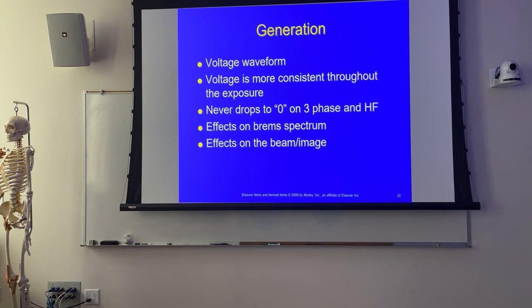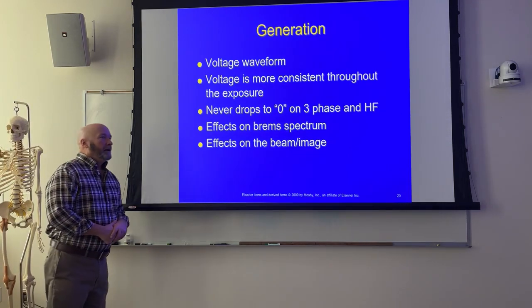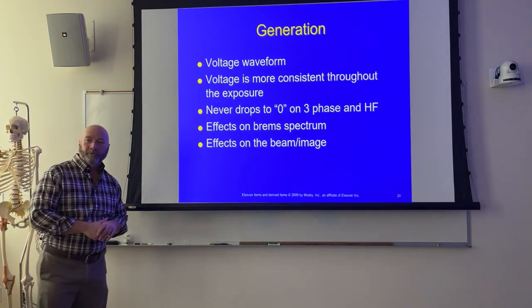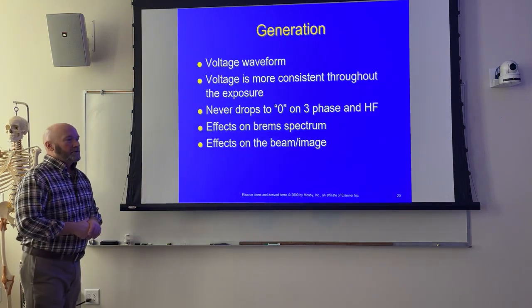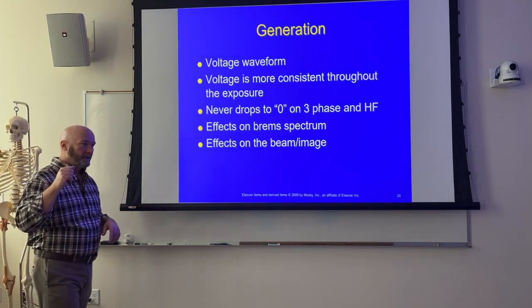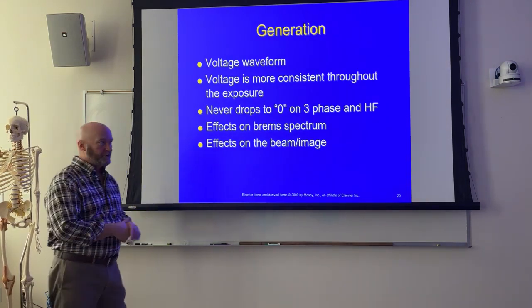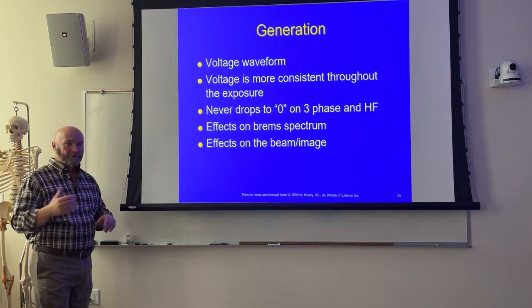Okay, so voltage waveform, again, we've got a number of different things to consider in voltage waveform. Single phase, regardless of whether it's full wave or half wave rectified, is still 100% voltage ripple. Three phase, we've got three different levels of voltage ripple.